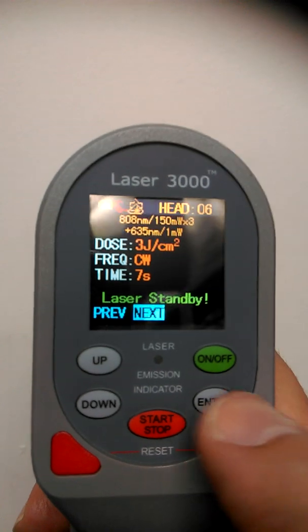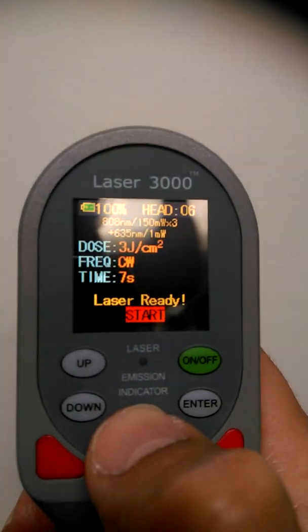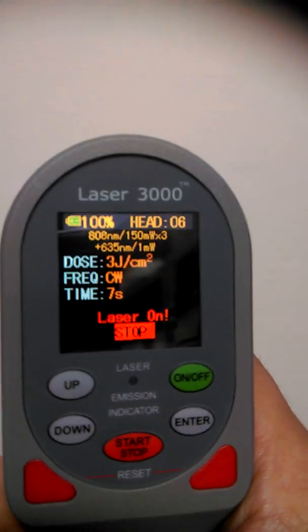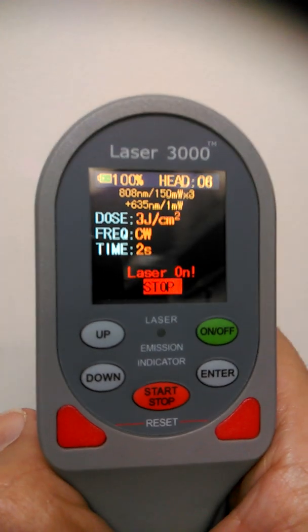If you want to do the same dosage again, just press enter, make sure the glasses are on, press the start/stop and off we go. As you can see, a very simple, straightforward, and easy to use product.